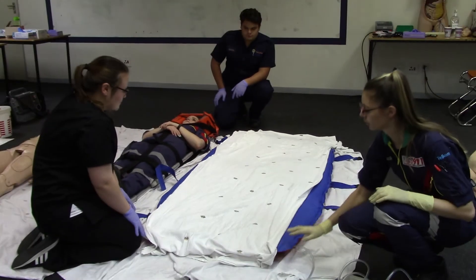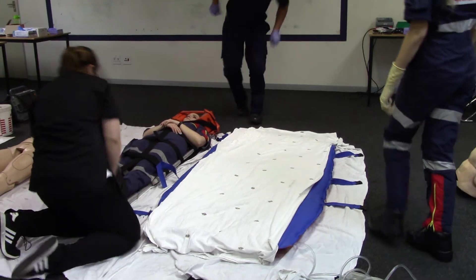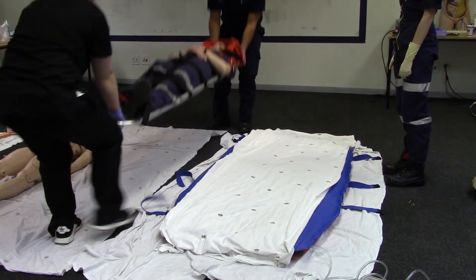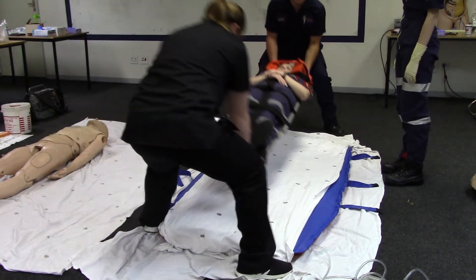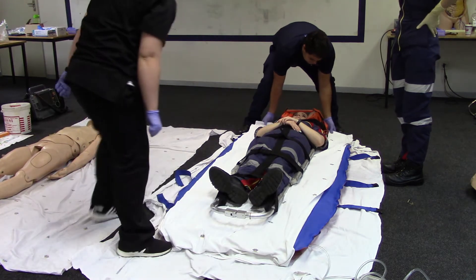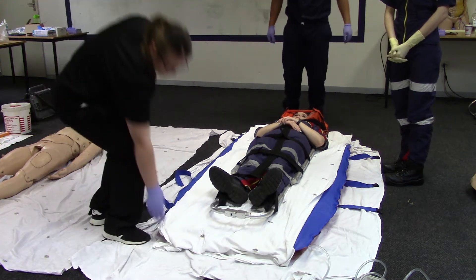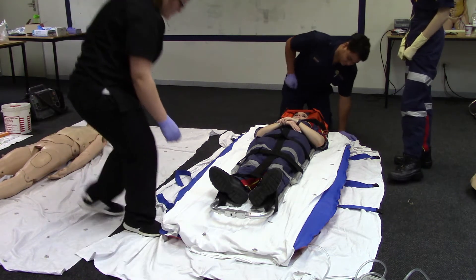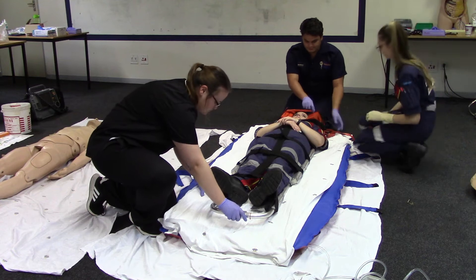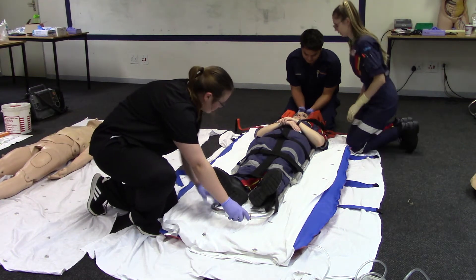Place the scoop stretcher with the patient in the center of the mattress. Unclip and remove the scoop stretcher slowly without causing unnecessary movements, ensuring that a rescuer is maintaining cervical spine immobilisation.